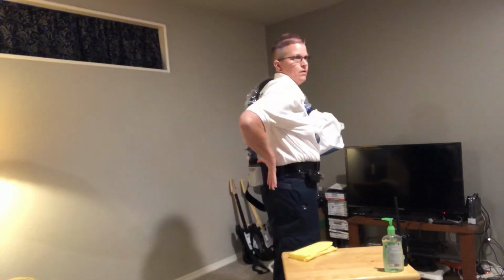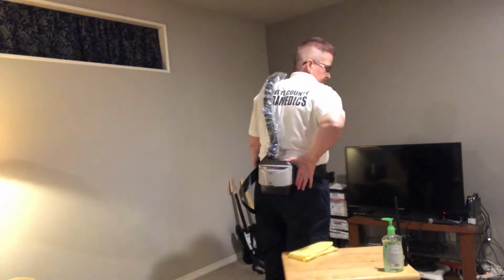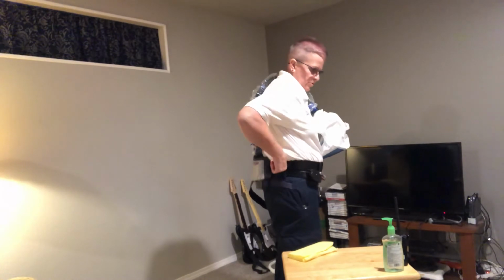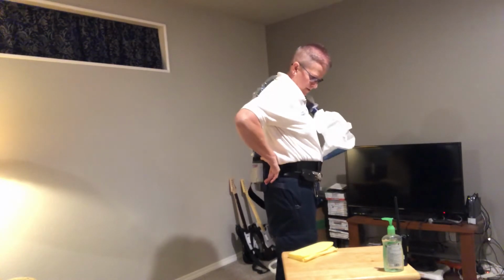Some people have their partners do that. However, knowing how to do it yourself and what you need to be looking for and checking for is obviously the best. So somewhere behind you or to your side where you can easily access it and get to it. Okay, so where Jody has it's fine. Make sure the belt's tight. Again, you don't want it dropping off or sliding down mid-contact with the COVID patient.